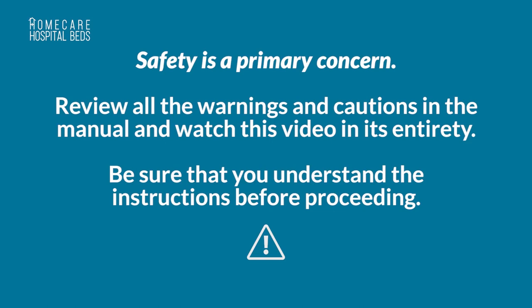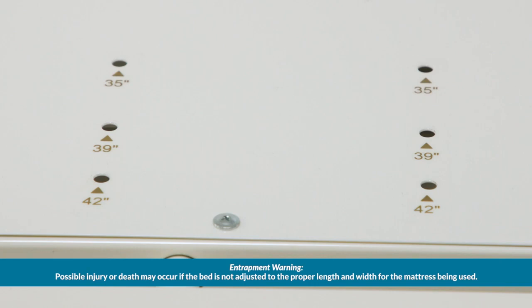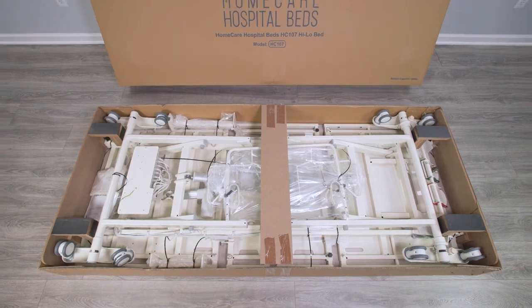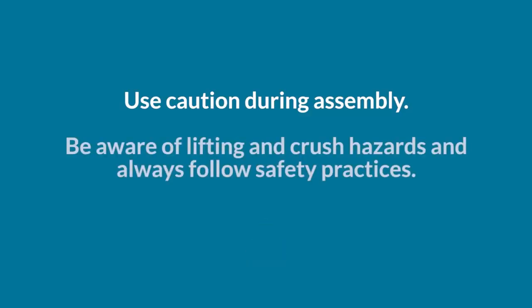Be sure that you understand the instructions before proceeding. The Linicare HC-107 can accommodate mattress lengths of 80, 84, or 88 inches and mattress widths of 35, 39, or 42 inches. The bed must be set correctly for your mattress. It may be necessary for two or more people to help move the box. Use caution during assembly. Be aware of lifting and crush hazards and always follow safety practices.